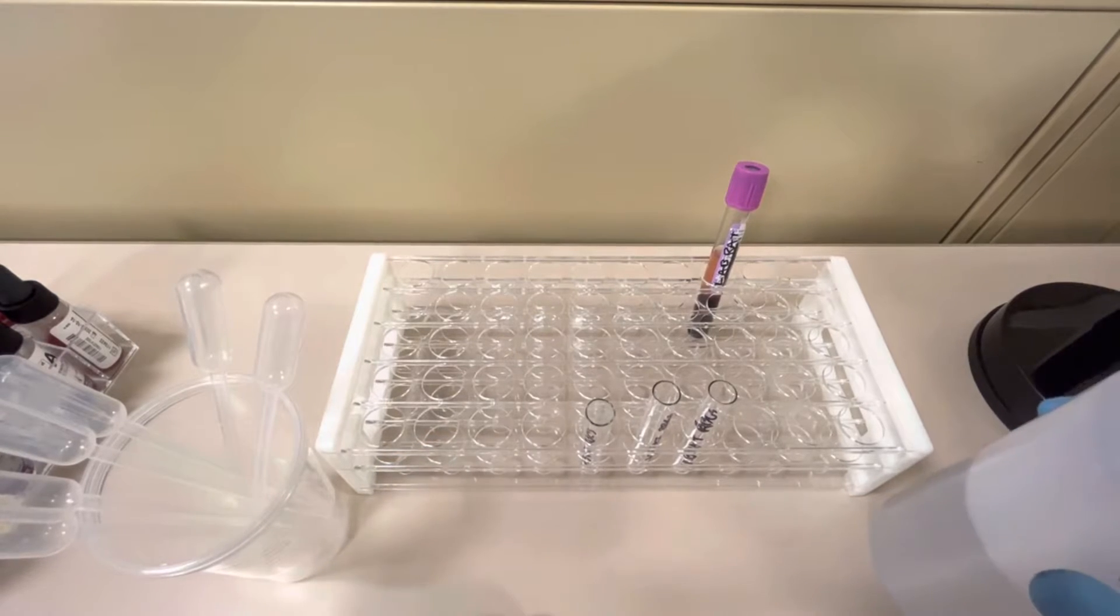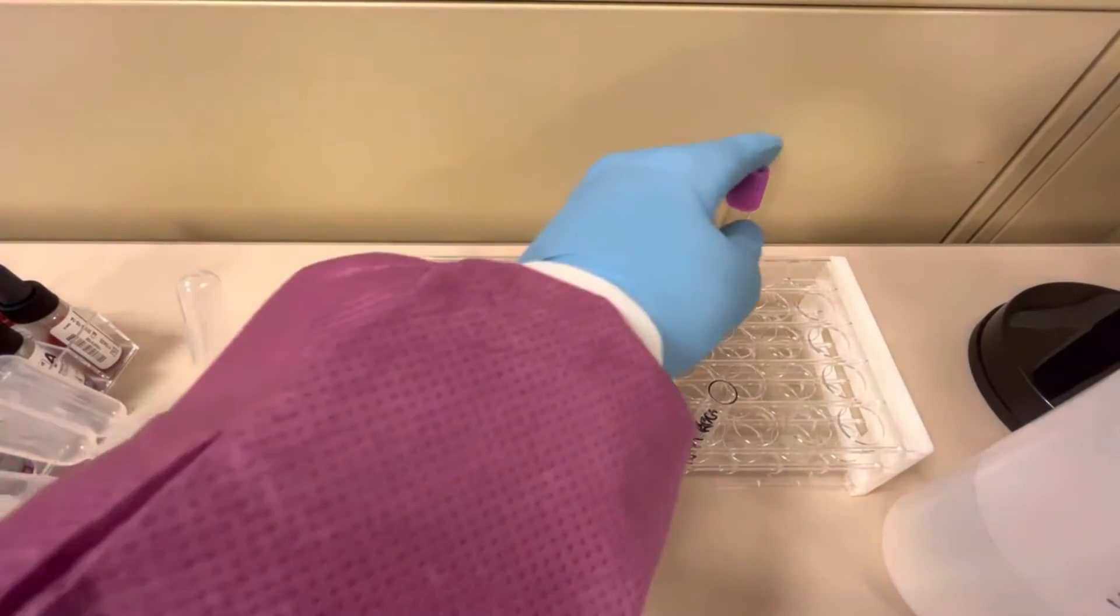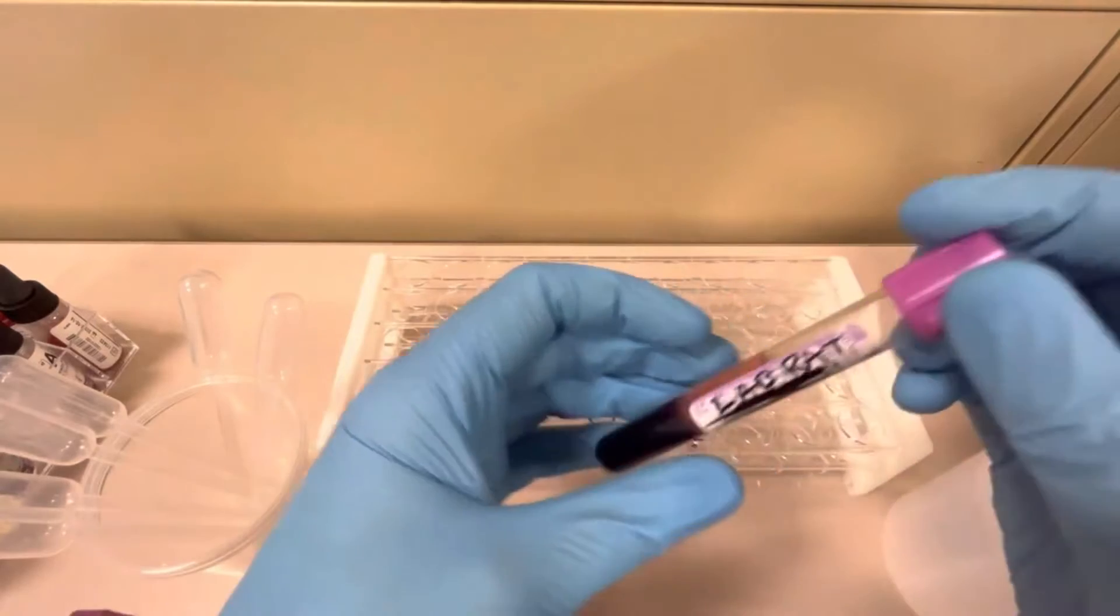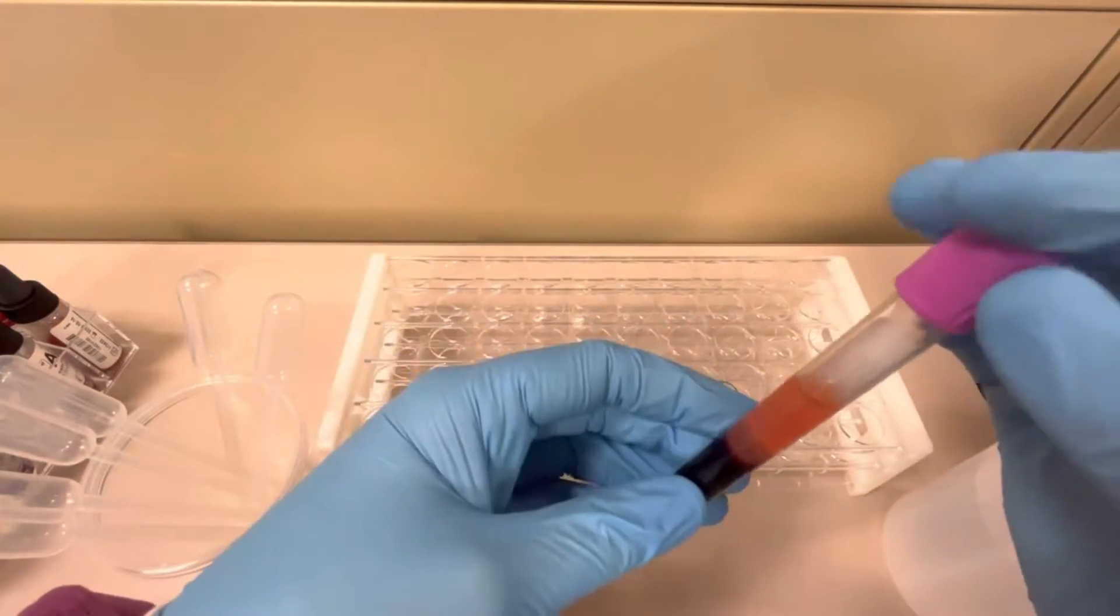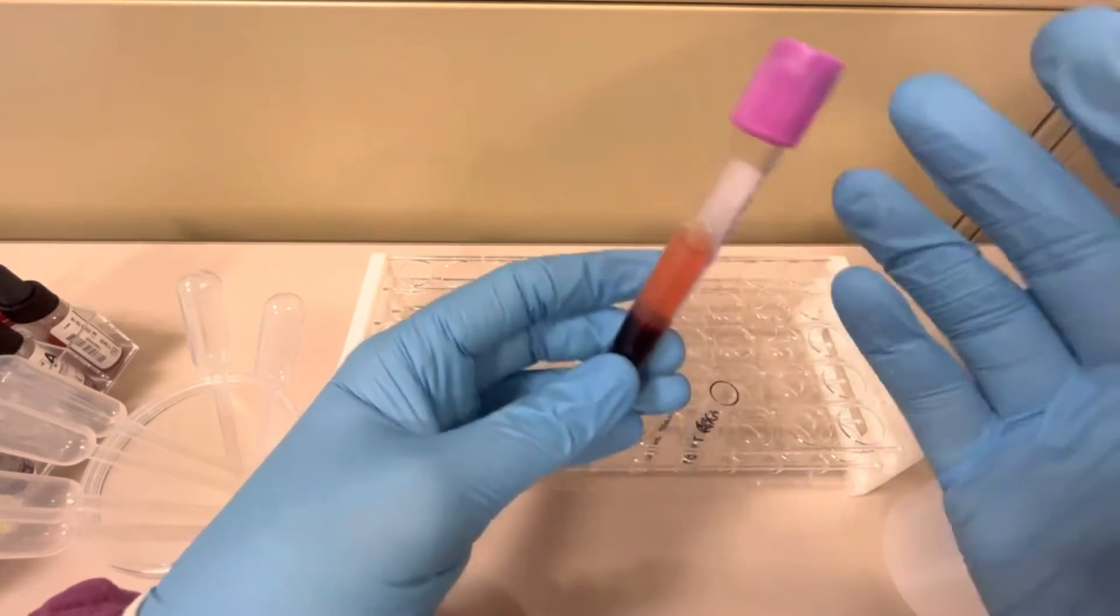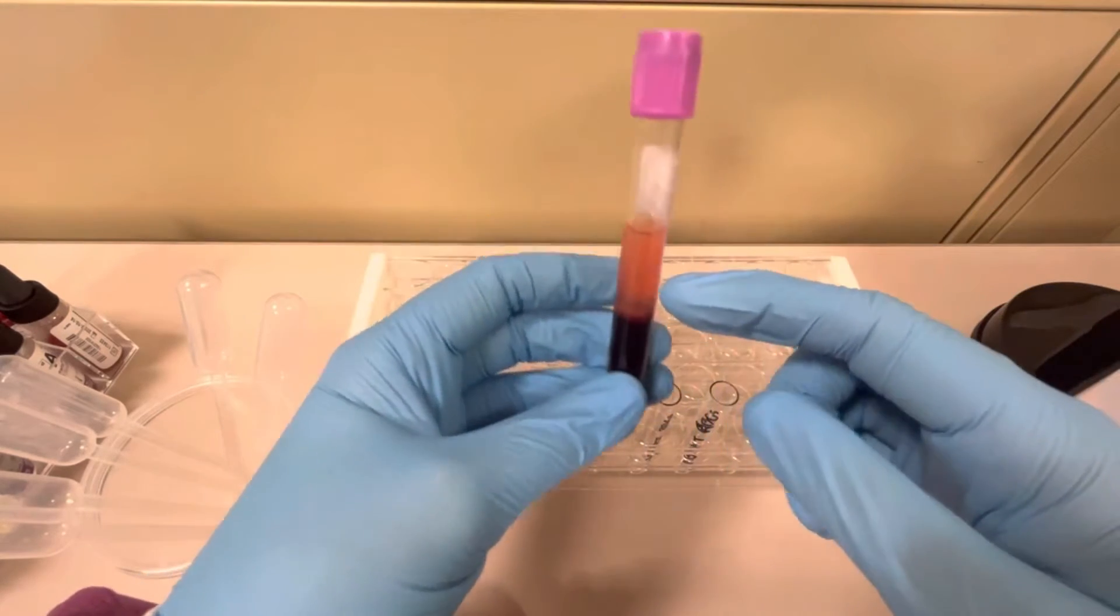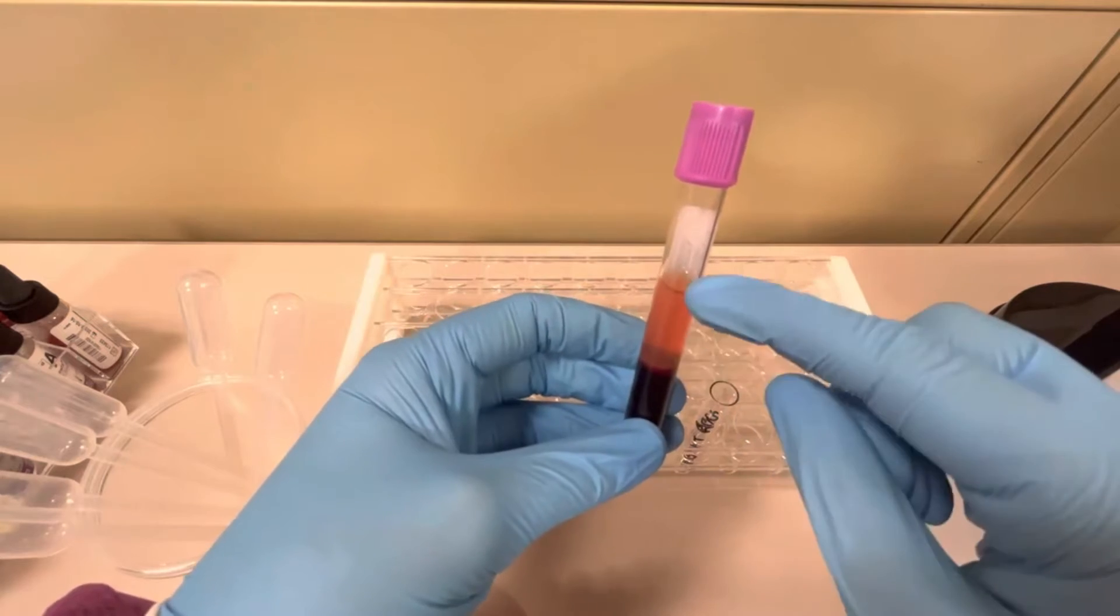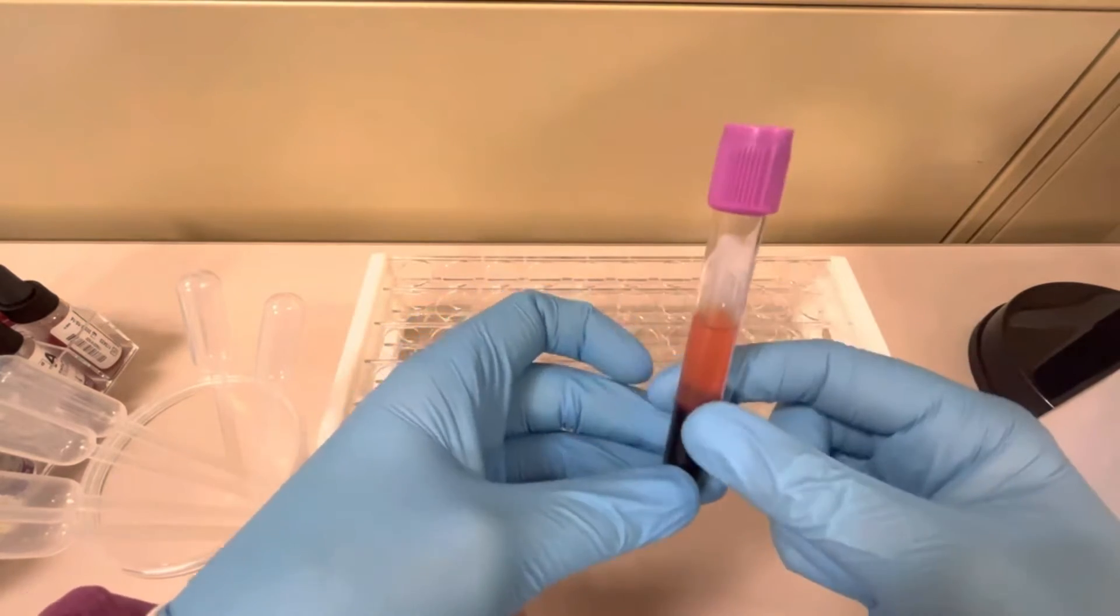So I'm going to show you how to do it. What I've done here is I've gotten my supplies ready. First I have a properly identified patient sample. It's named Lab Rat. This is actually a phlebotomy student of mine that donated their blood for this procedure. It's properly spun so this is the plasma on top and the red blood cells here down at the bottom.